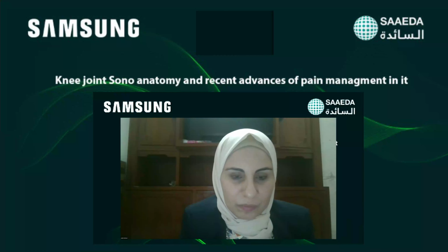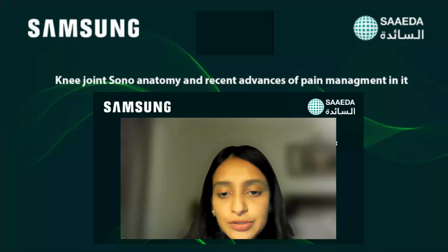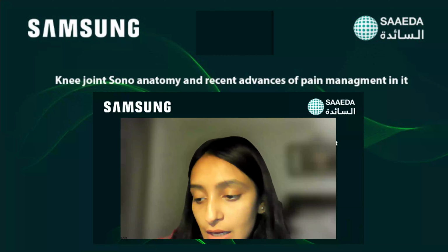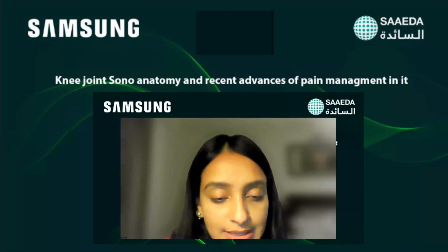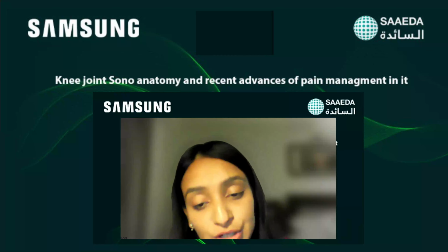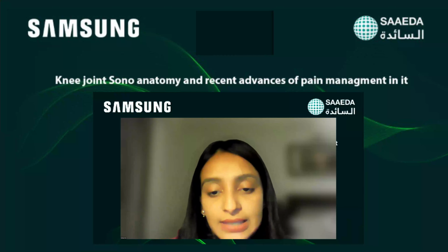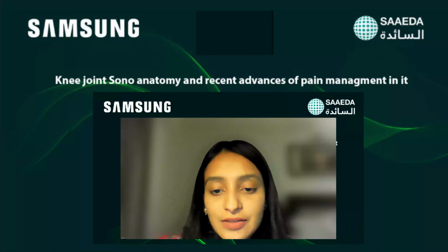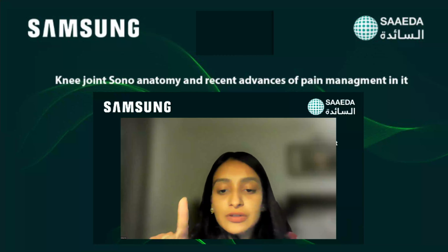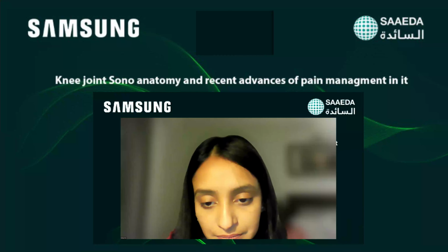Yeah, basically you're correct. What we do is first locate the nerve in the short axis, and then in the longitudinal axis. It is our assumption that the nerve lies along with the vessels. So if we are tracing the nerve along the longitudinal axis of the artery, then we are assuming that the nerve is also lying parallel to it. So it will give a better lesioning.